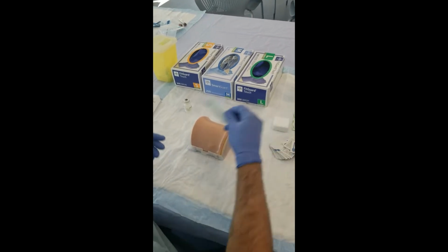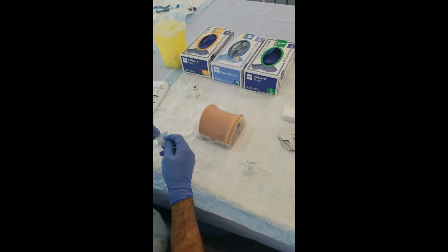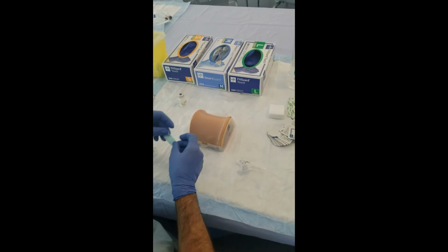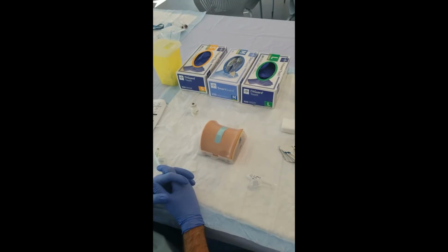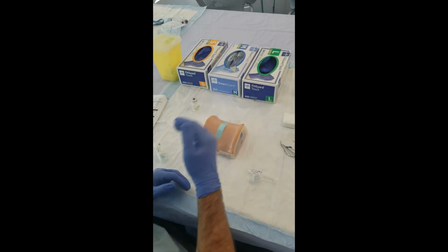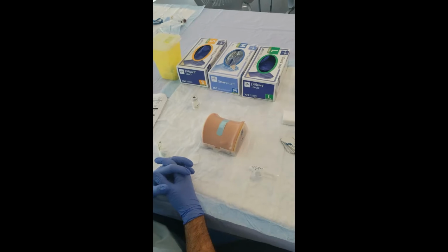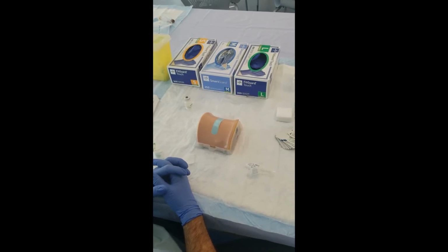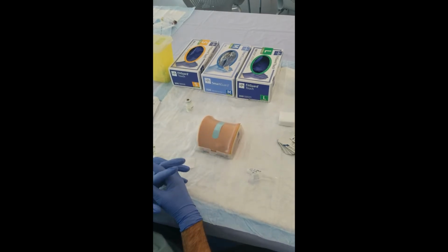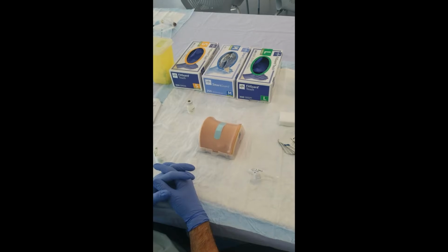Placed Band-Aid on site. Step 28. Student stated, I would give the patient instructions to check for signs of infection. Step 29. Student stated, I would now document in the patient's chart the date, the time, the needle gauge, the location of the injection site, any complications, and any follow-up instructions that were given.